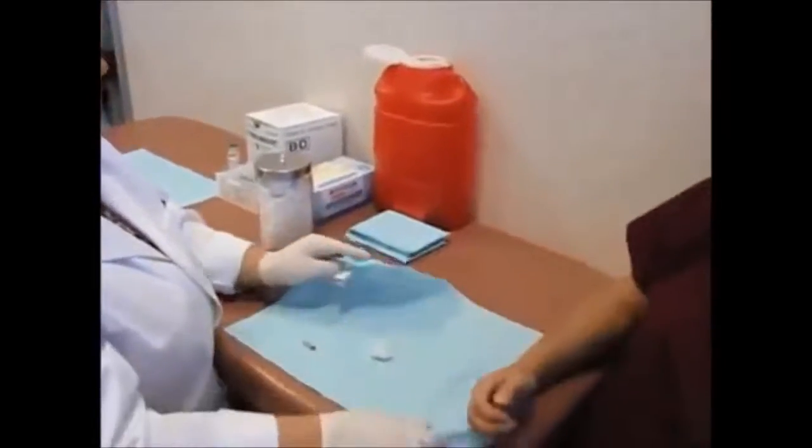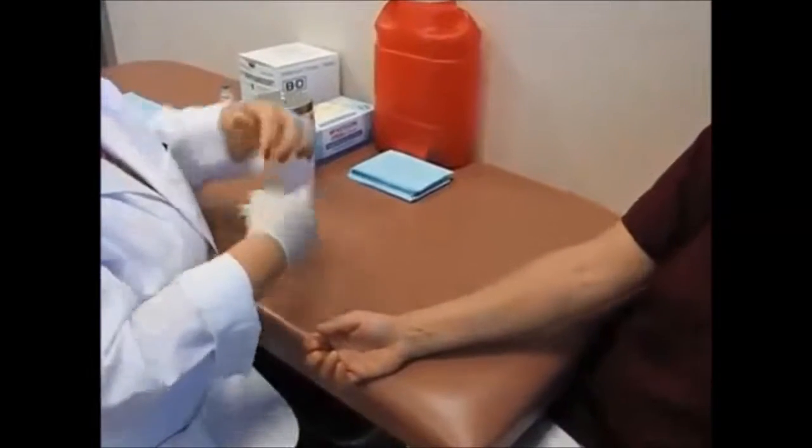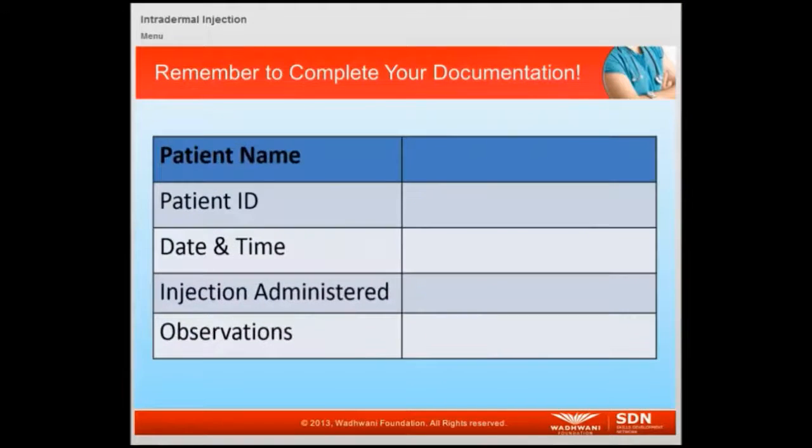Thank you. So if you would remove your arm, cleanup for this skill is just to remove your tidy towel and all your supplies and your gloves. Always remember to complete your documentation after the procedure is done.